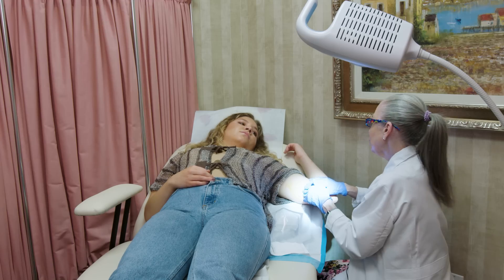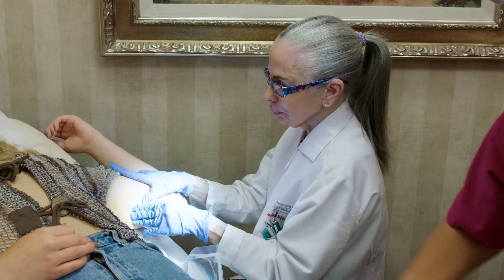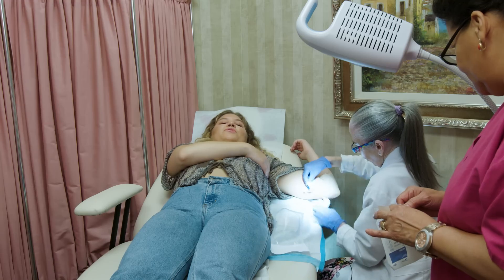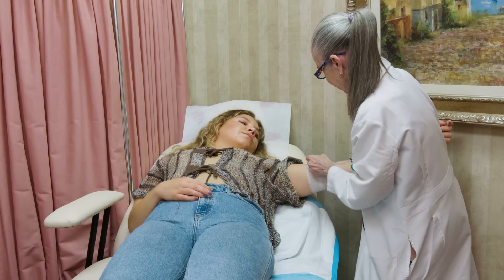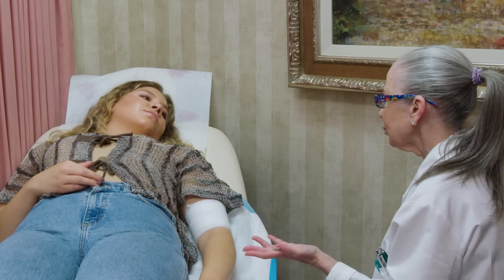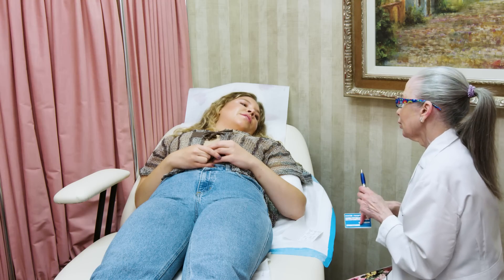Your periods may not be normal, or you may not get a period at all, which is wonderful. I want you to look at the incision — it's really small. We're going to wipe your arm and put some steri-strips on there. I expect you to feel exactly the same today. So all I expect is a little bit of bruising, and you're bruising already — you're very fair. When I touched it, it just felt like a little rod in my arm. I want to leave the dressing on for 24 hours and keep it dry. This is very different from an IUD — I don't expect you to have any cramps or discomfort. The only thing you could have is some unpredictable bleeding. If at any time you want to get pregnant, we can remove it, and fertility is not delayed at all after removal. You can remove this rod anytime you want — you don't have to keep it for four years.